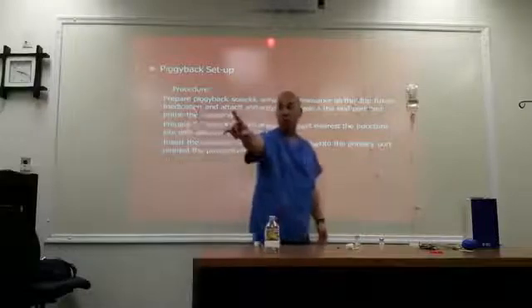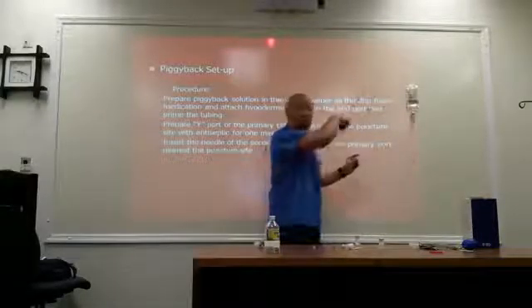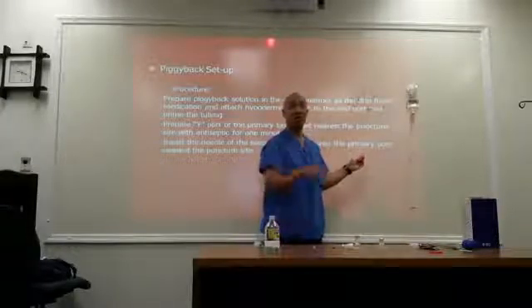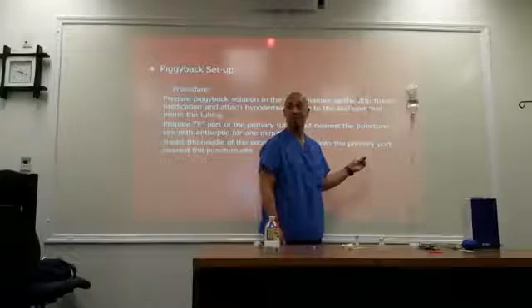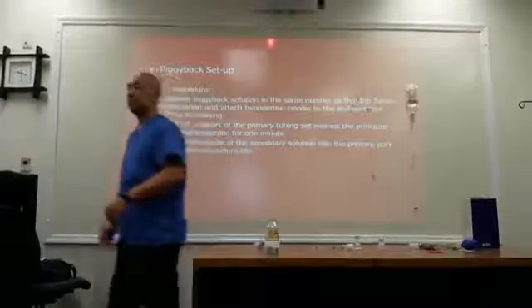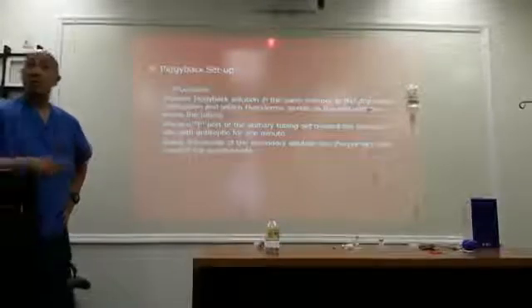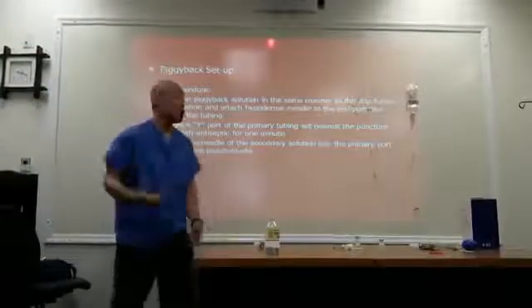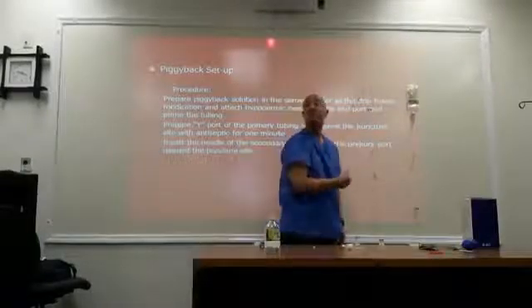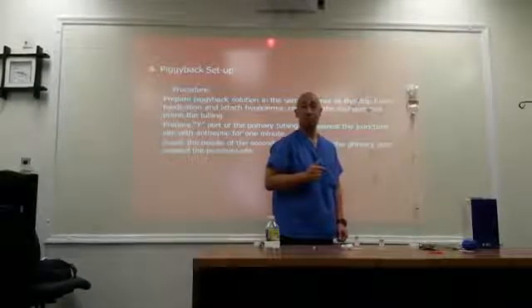Another thing that you want to consider is that whatever you got going through there is compatible with what you're using, because you don't want to mix anything that's not compatible. Okay? So whenever you do a piggyback, are you going to be using the direct push method? Yeah, with piggyback you can use direct push, or you can hook up another line to it and drip infuse it. Either one. Okay? Got it.